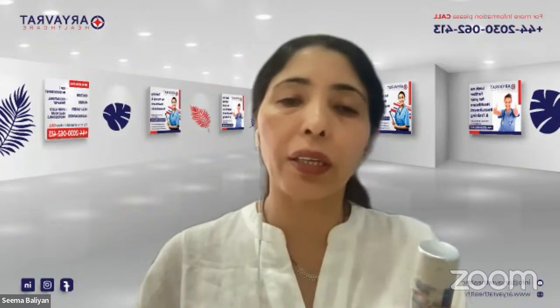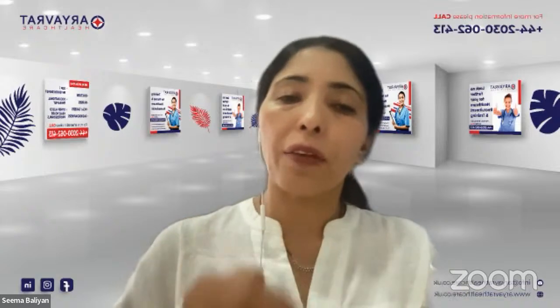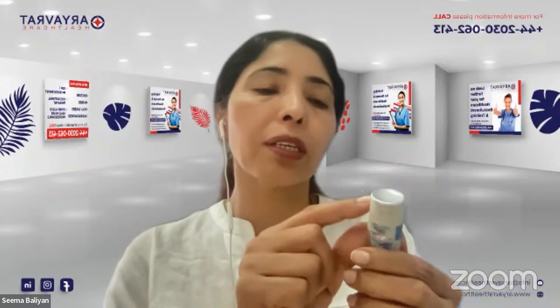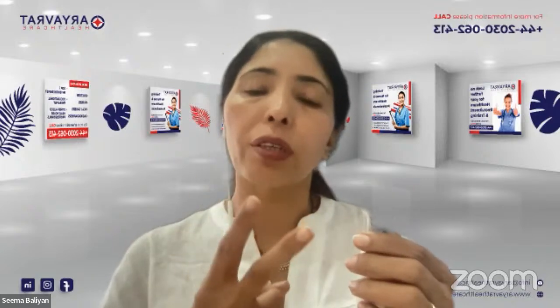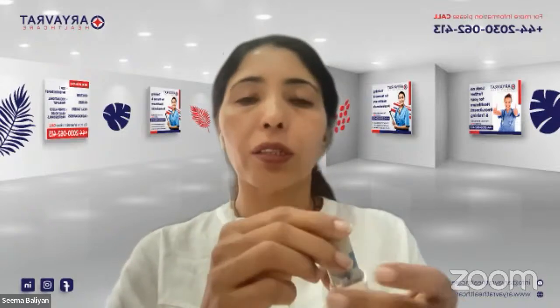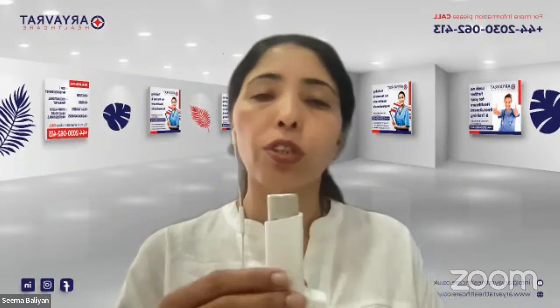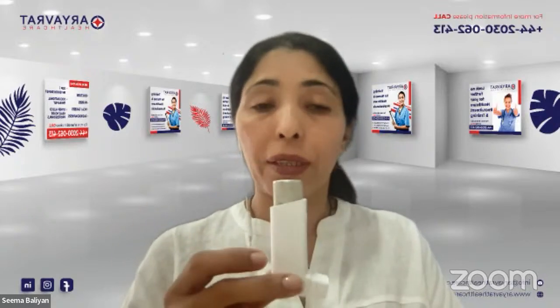They are also going to give the time, the doctor's signature, and prescription and bleep number is written. Start date and finish date is also written. So all your R's are correct. And you are going to be checking that yes, the medicine contains 100 microgram in 1 puff, and my dose is to give 200 microgram or 2 puffs that I will be giving. I can also check that it is within expiry and it is safe for me to use. So at the same time, when you are checking the canister, you have also checked that the 5 R's of the medicine are there.